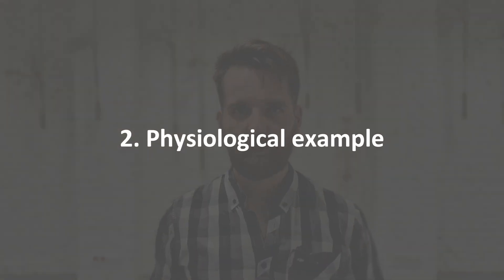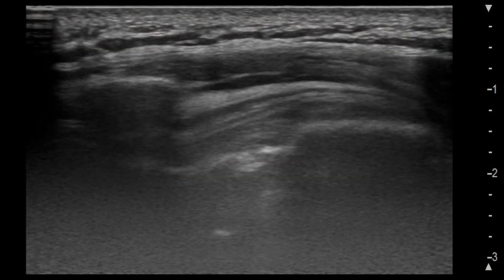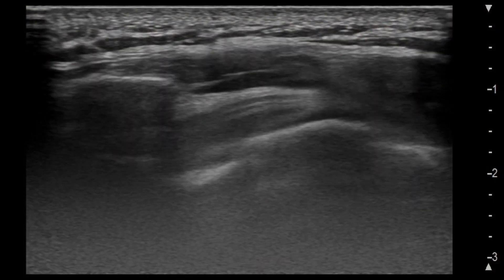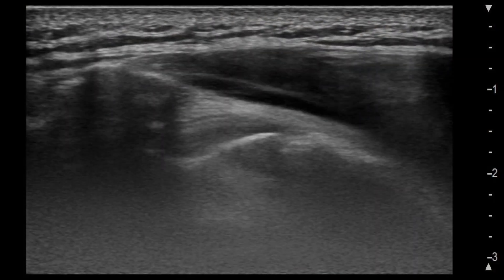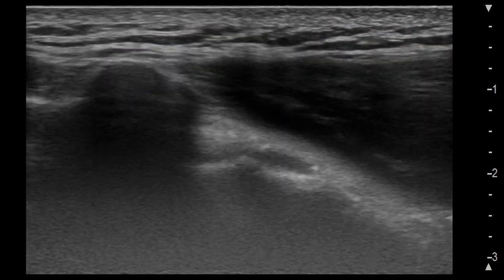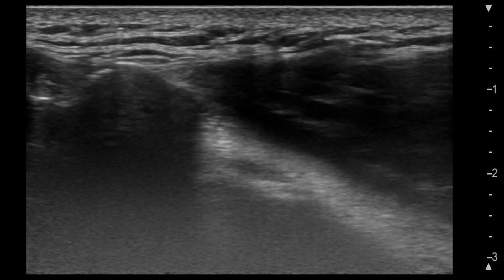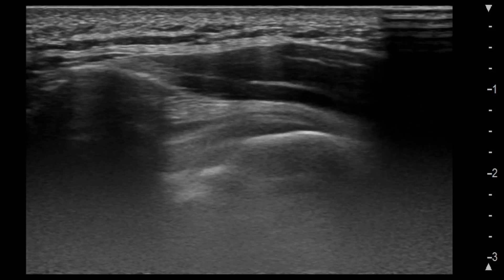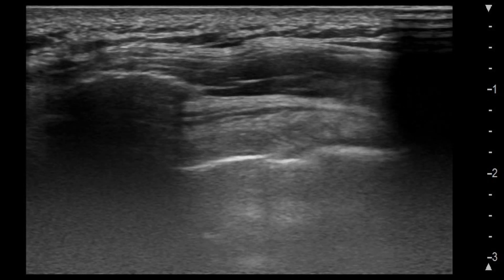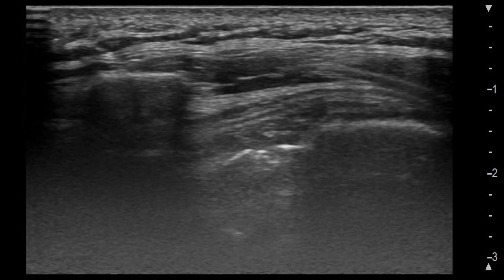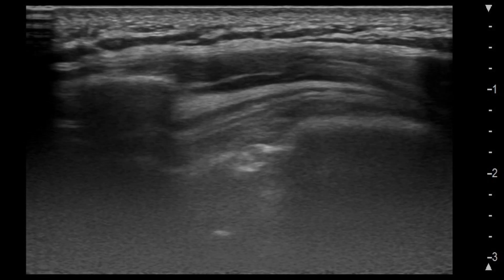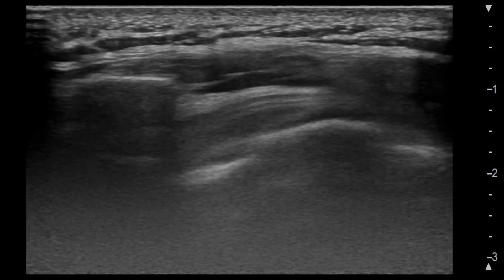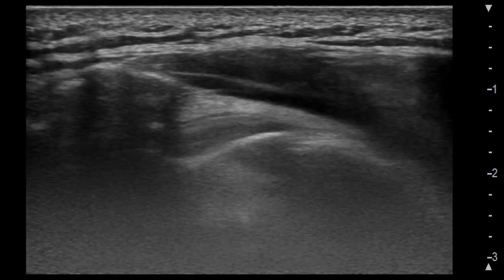Physiological example. In a healthy shoulder the humeral head will move smoothly beneath the acromion as the patient slowly abducts the arm. This smooth motion is what we want to see — no interruptions or unusual contact between bony structures.